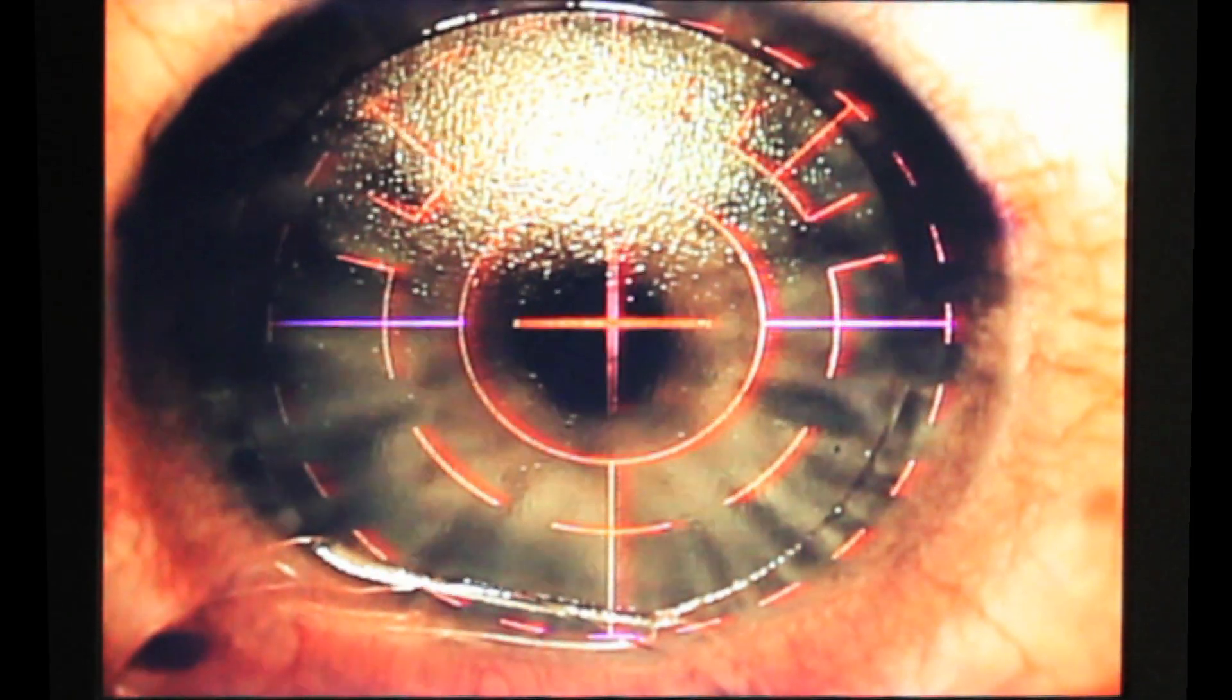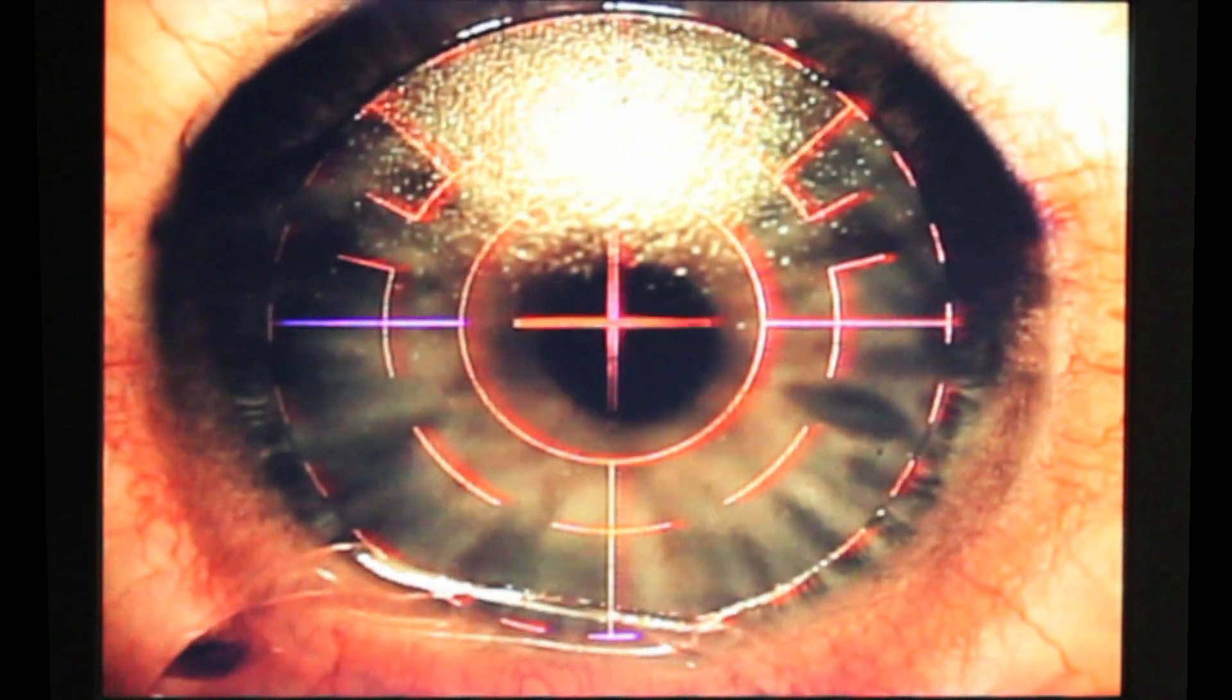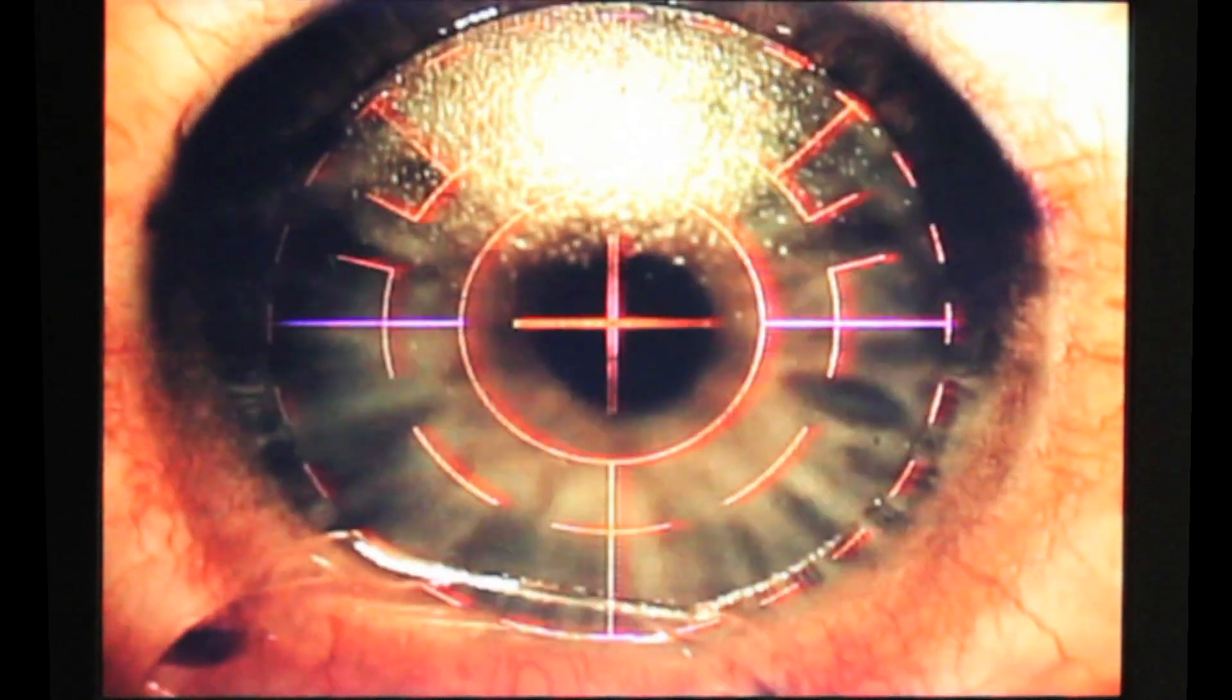So, he acquires the target. He locks on. I feel like we're going to have a Star Wars Tie Fighter. Then he starts vaporizing flesh.